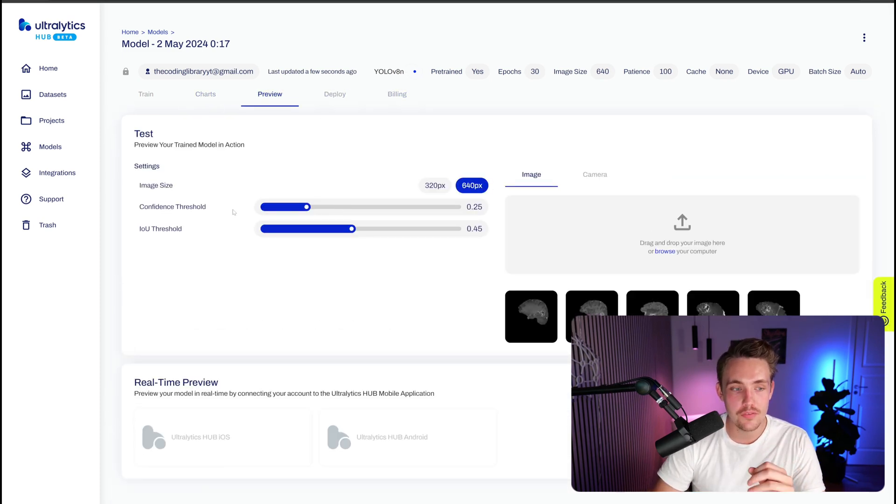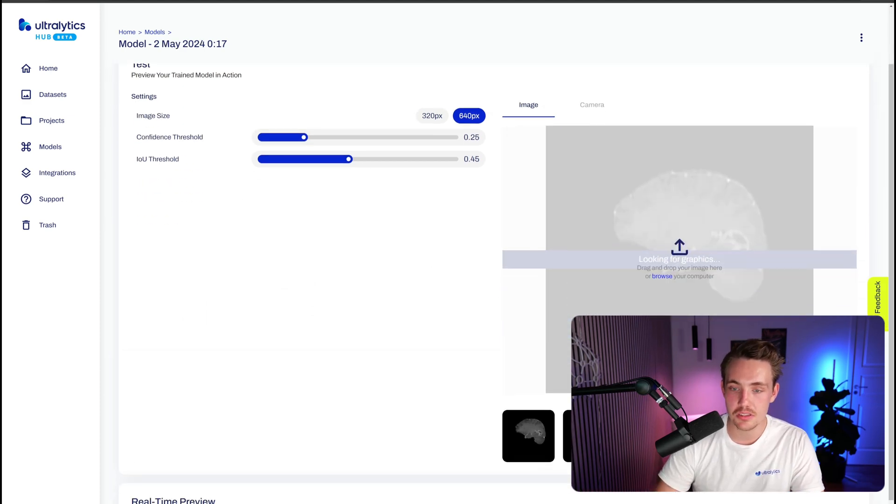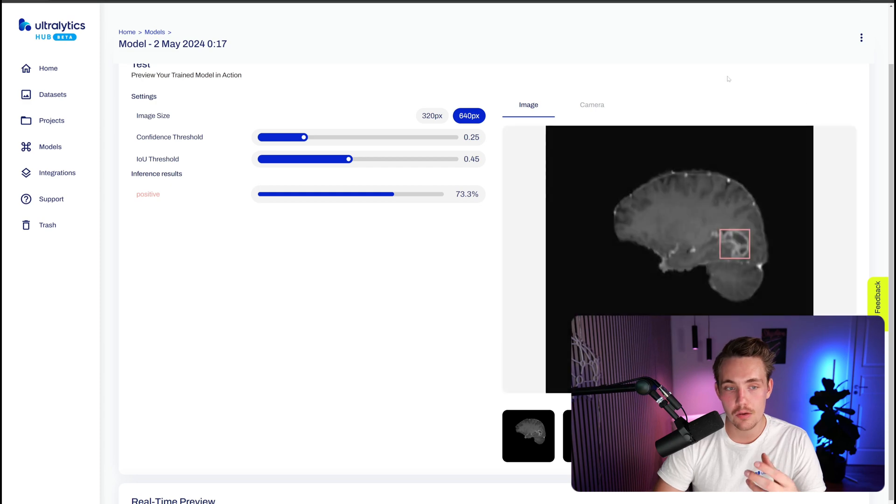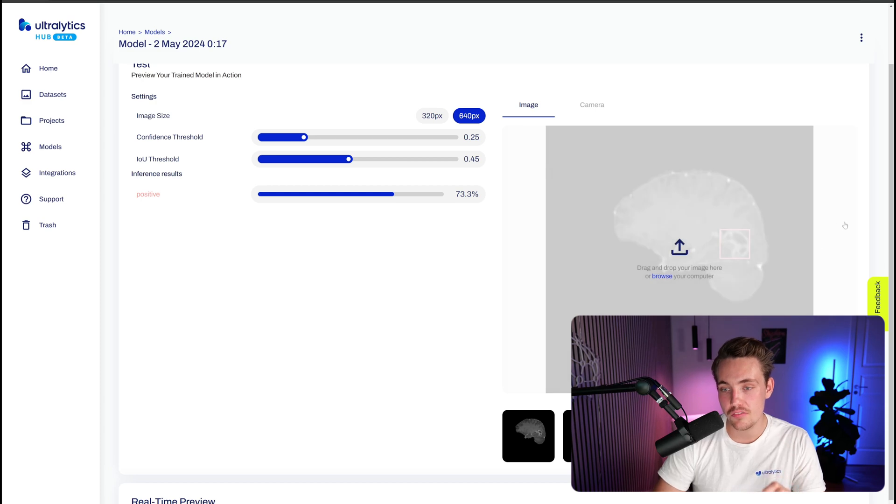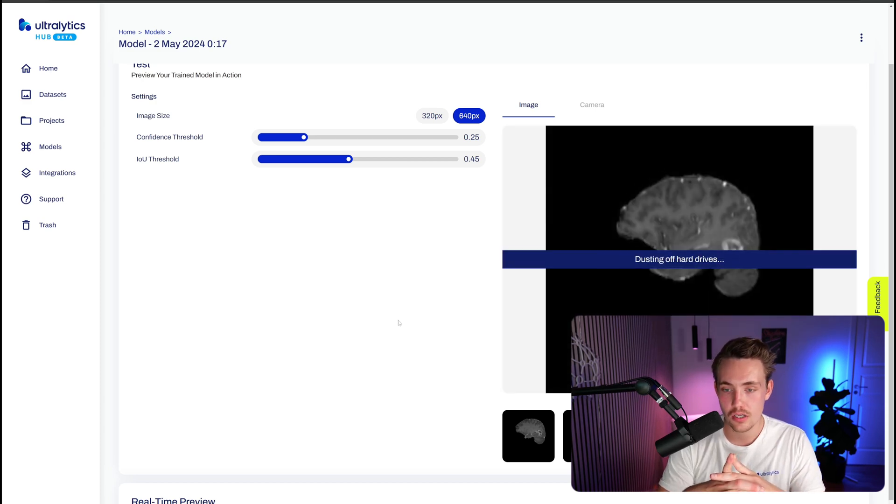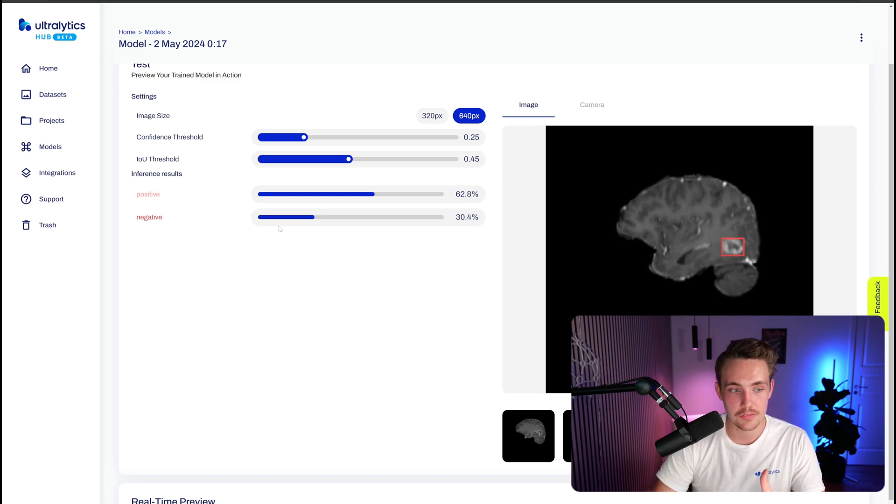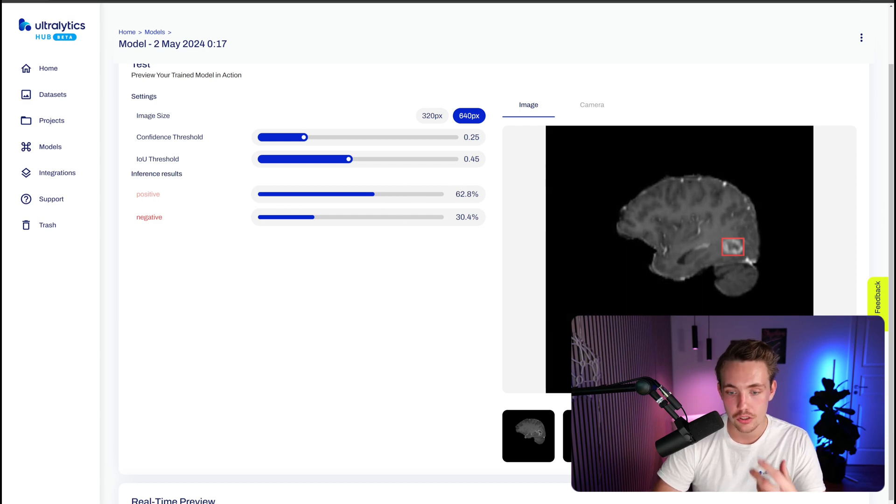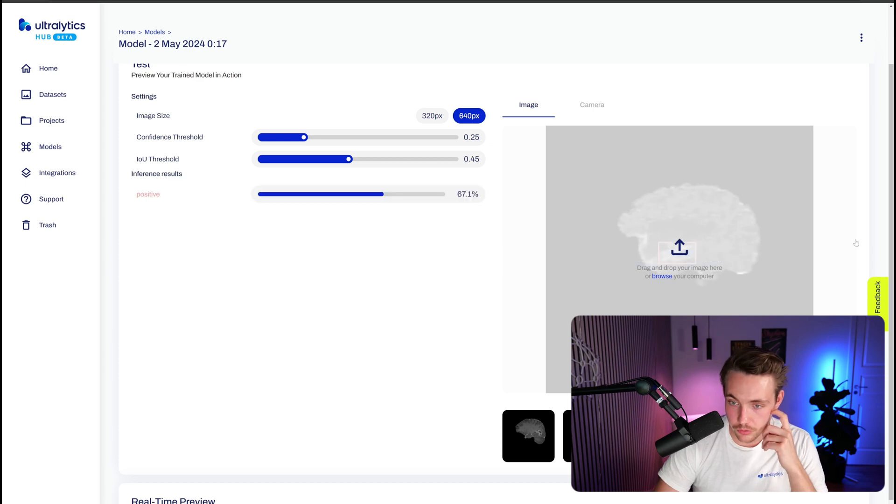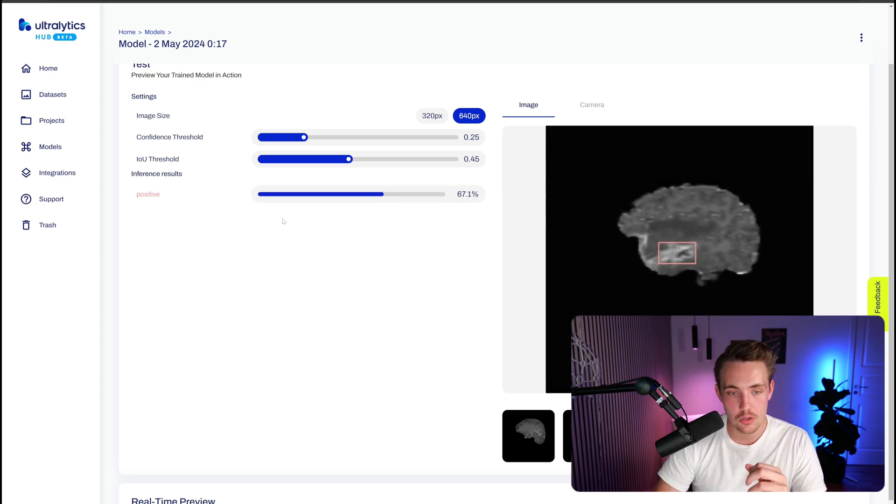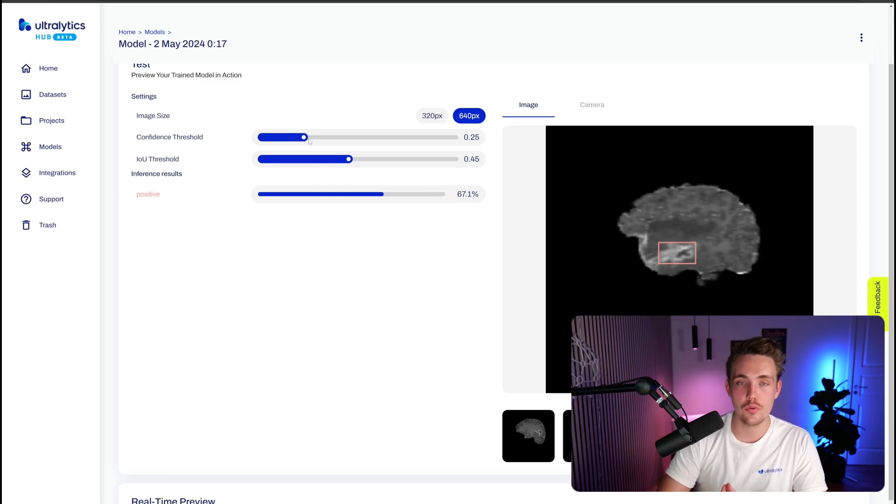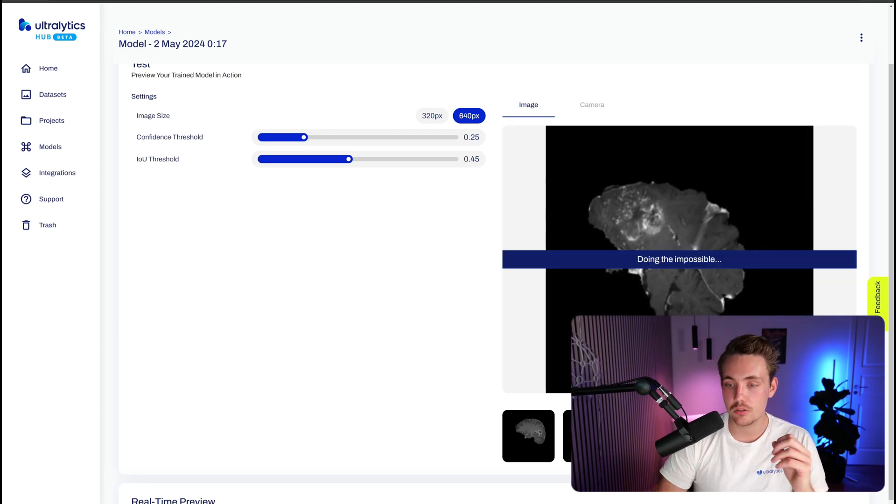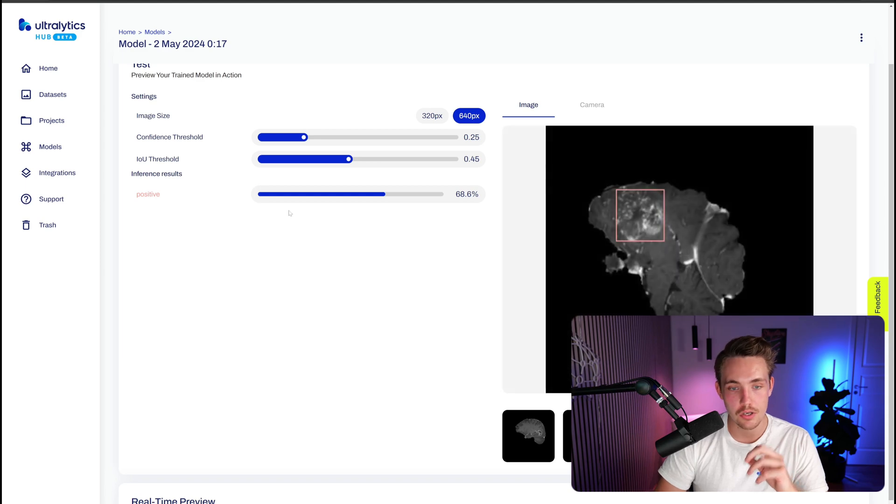We're going to take a look at the preview. We can set the confidence score and intersection over union threshold. We can take a look at some of the test images. We can also connect the camera or upload our own images. This is just to verify how your model performs. Here we see we get the output - we get a positive detection with 73.3% confidence. This is actually pretty accurate. Let's take a look at another one. It's just doing inference, taking the model, processing it, throwing it through. Now we can see that we get a negative detection and also positive. These are the confidence scores for those two detections. If we take a look at one more, we should be able to get some more detections. Right now it's positive. There we go, with fairly high confidence as well. You can always play around with the confidence score here, have it higher or lower depending on if you want to be more certain in your prediction. Let's take a look at the last result here. We should get some detections up here at the top. There we go. And it is a positive brain tumor.